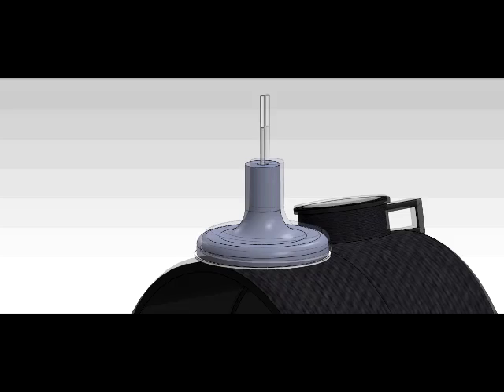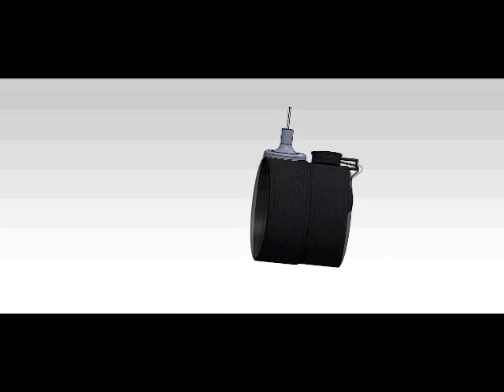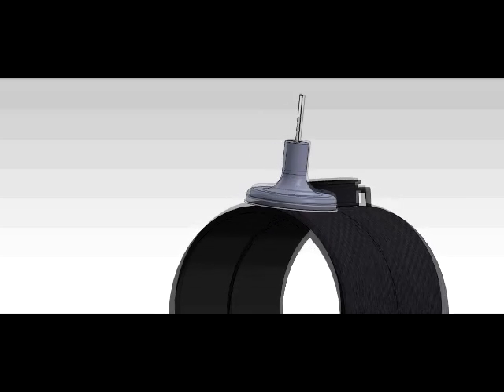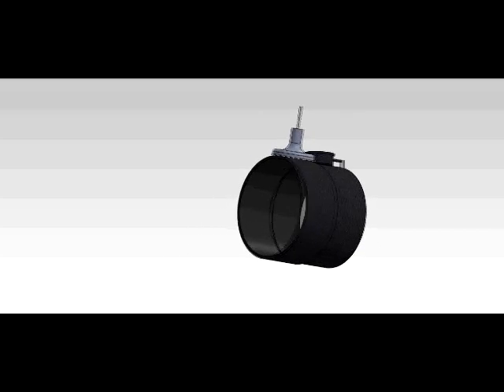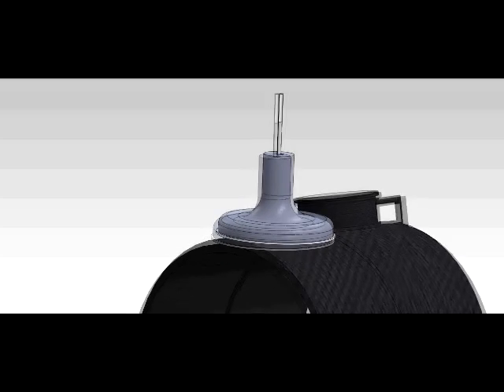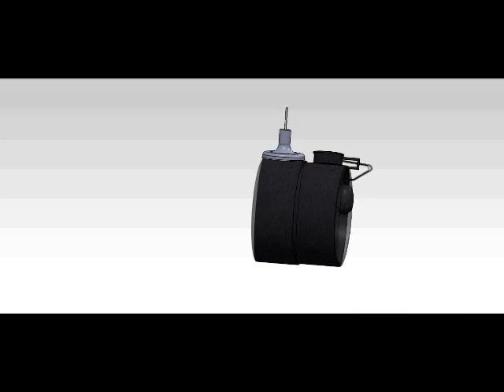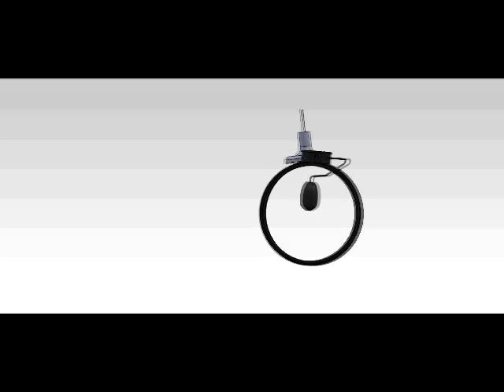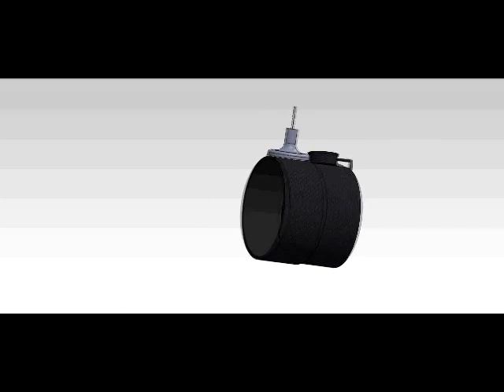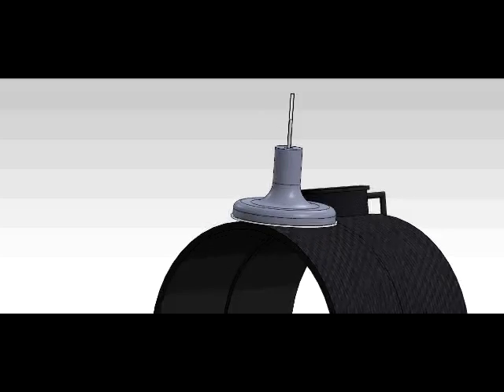There are a number of reasons why we decided on our prototype design. Considering the problem that we are trying to address, we expected our device to be simple and straightforward by nature. Our prototype device has shown to most closely follow our design criteria. The design of the device, as well as the operation, is both clever and intuitive, offering an effective solution to monitoring blood pressure without the use of electricity or expensive components. Due to its simple visual output, our device can easily be used in regions worldwide with minimal training.